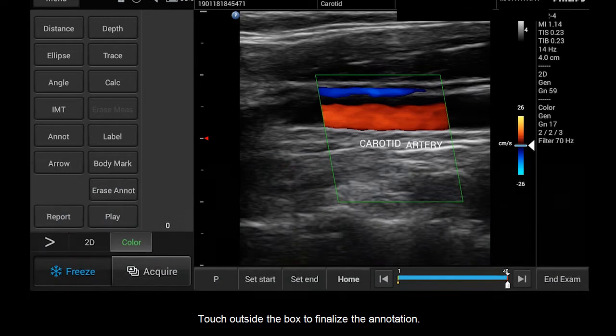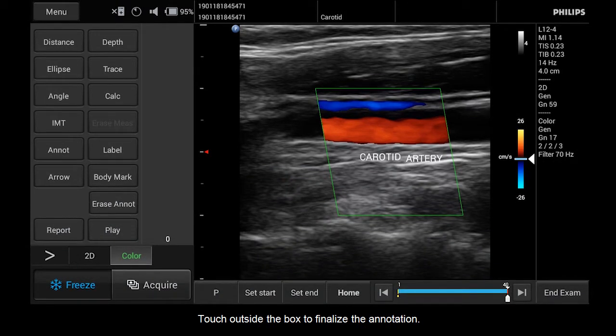Touch outside the box to finalize the annotation. The QWERTY keyboard disappears.